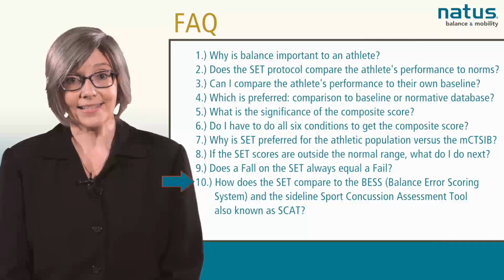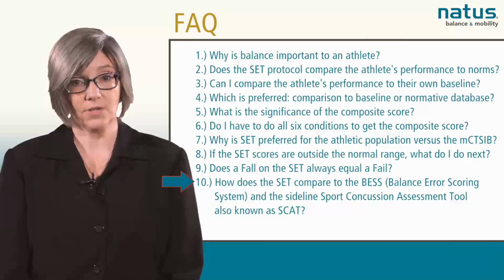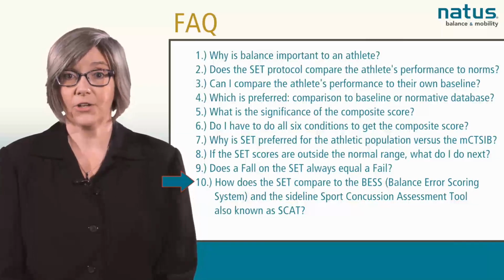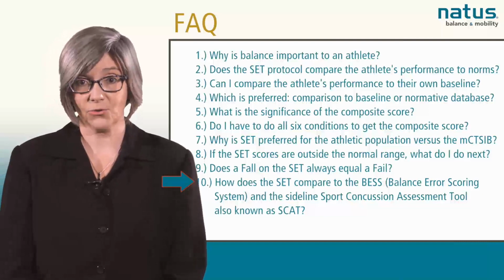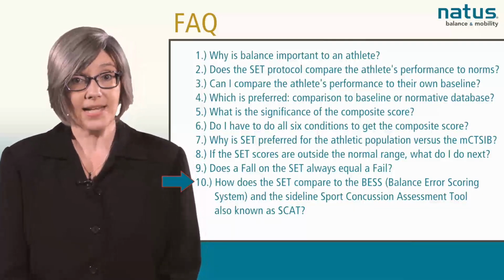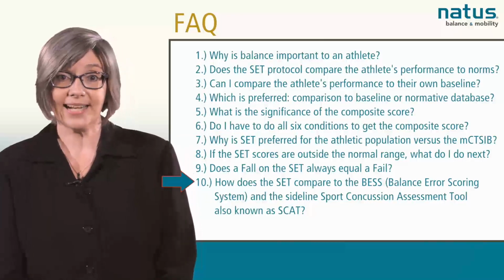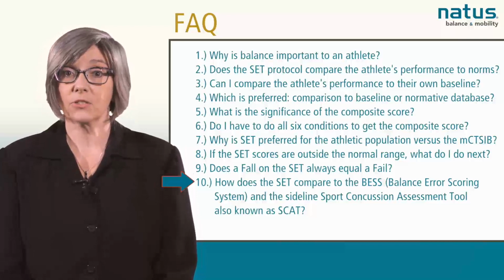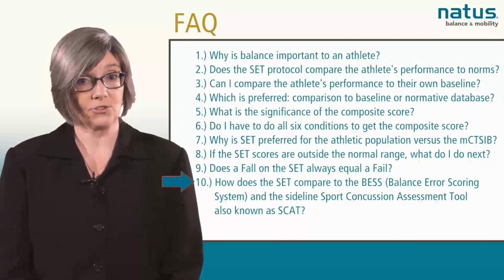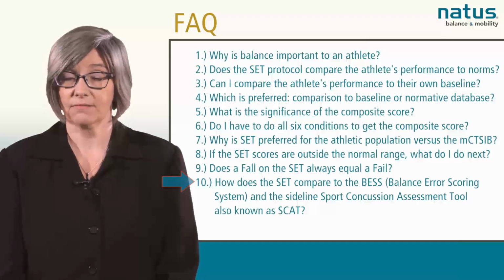The SCAT is a sideline assessment incorporating 3 key components for injury assessment: symptoms, neurocognition, and balance control. SCAT is used to make fast, immediate return to play decisions. As this assessment is often completed on the sideline, performance and scoring are susceptible to environmental distractions. The scoring of the SCAT, by definition, is subjective.